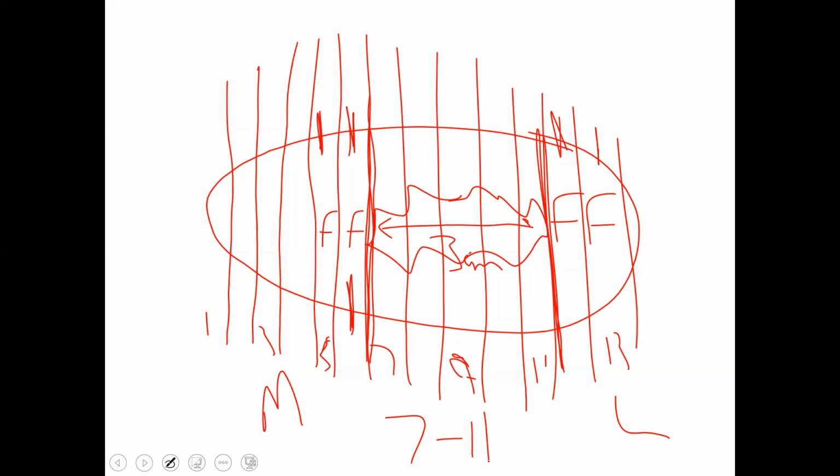If you tell me it said 6 centimeters of non-mass-like enhancement, I'm going to say, where is that 6 centimeters? We need to confirm at least 6 centimeters of disease, or confirm some sort of pathologic abnormality that would explain the non-mass enhancement present on the MRI. So use the imaging. It will always guide you along.